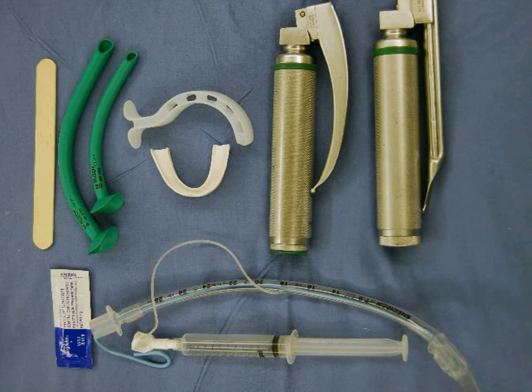Ensuring that airway equipment is available prior to the procedure is critical to a successful intubation. Obtain 2 laryngoscopes with blades and check to ensure that the light bulbs and batteries are working. You will also need an oral airway, a nasal airway, a dental guard, lubricant, an appropriately sized endotracheal tube with stylet, and a 10 milliliter syringe. A tongue depressor is optional.